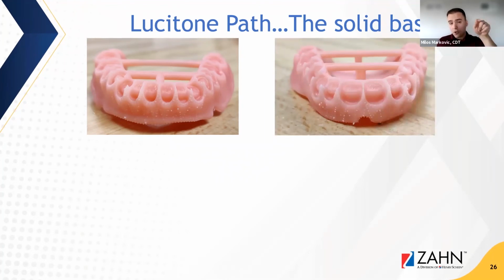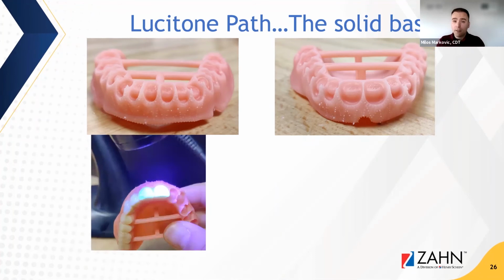Those bars that you see across are placed to prevent any warping during the 3D printing process. All dentures are printed at about 70 degrees. And so those bars prevent any warping during the printing, and they really help. Those are done post design. And they're all made for Dentsply's IPN 3D teeth. So those are placed individually.